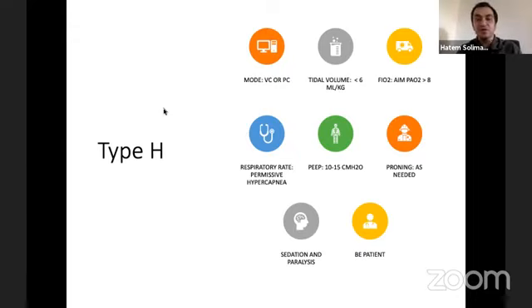And we often allow a degree of permissive hypercapnia in these patients, meaning that you will not be able to clear the CO2 completely. You would allow a degree of respiratory acidosis, which can be variable between 7.25 to 7.20, allowing the CO2 to increase, keep them sedated, paralyzed, but your aim is to maintain the plateau pressure, which is the intra-alveolar pressure, less than 30.